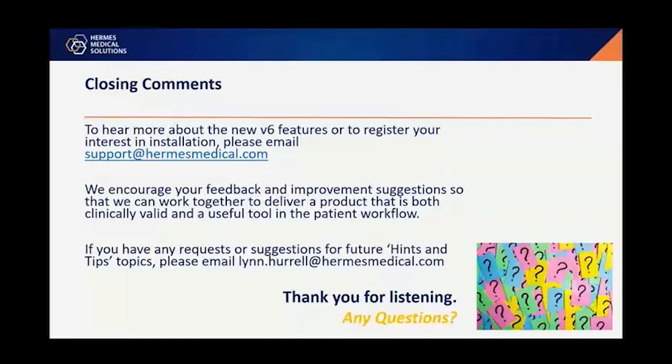Thanks, Gemma. Hi. I hope this is helpful. I did my PhD on cardiac MIBG. So the heart to mediastinum ratios are very dependent on the collimator used. So that normal range from the ADMIRE study in the US on heart failure, that's only valid if you use low energy, high resolution collimators, that 1.6 normal range.